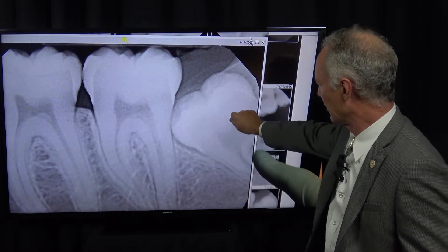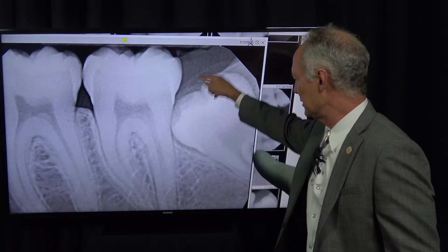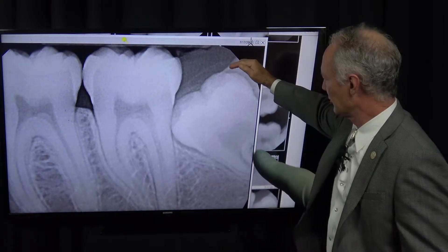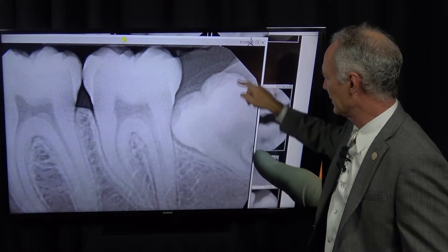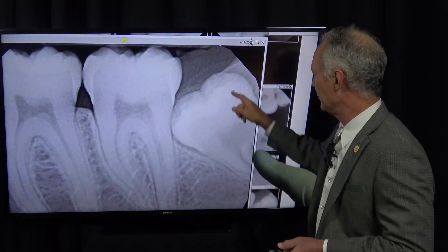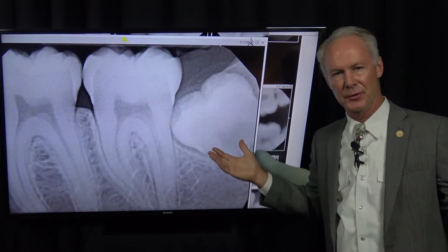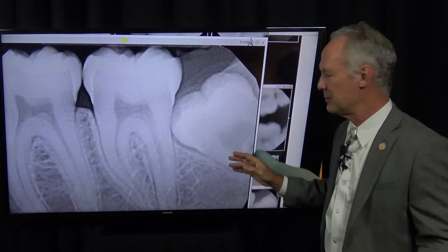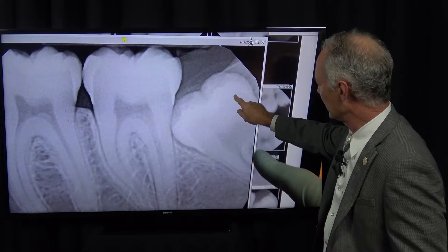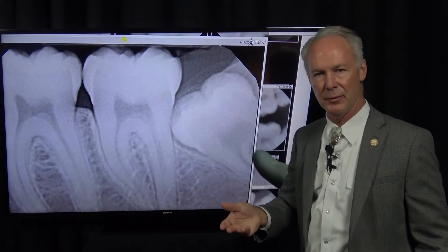Once I've sectioned them, I'm going to roll this piece out and then place an elevator right here and roll this piece out. Now sometimes if the alveolar bone surrounds the distal of the tooth, you can't get that part to elevate. You need to create some space — don't cut the bone, cut the distal of the tooth. You're going to lose the tooth anyway, all you need is space. Cut the distal of the tooth down to about right here and you'll have space to elevate into. Don't cut that bone because that could be painful post-operatively.